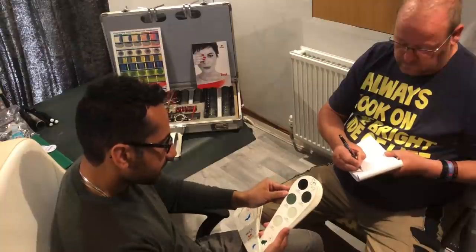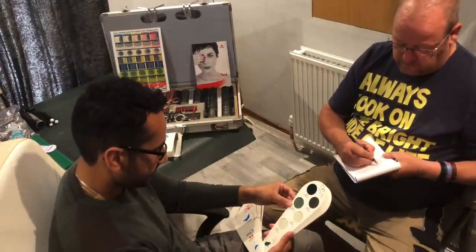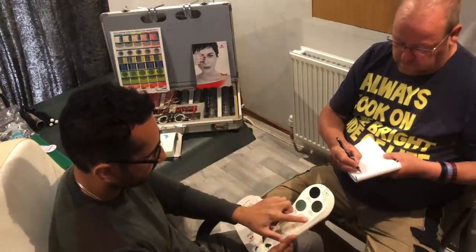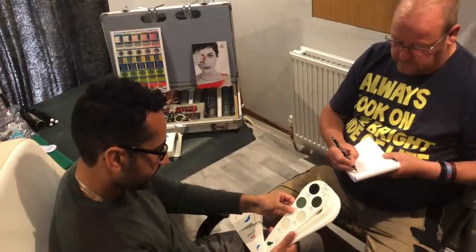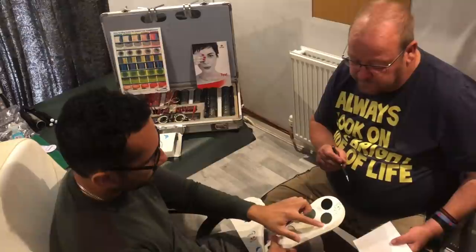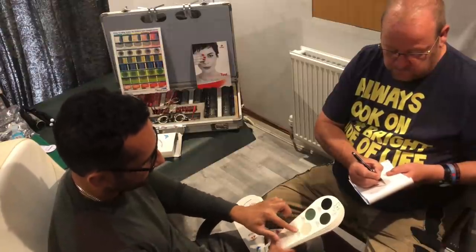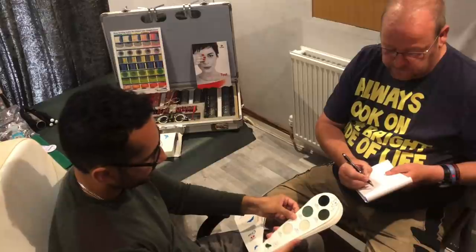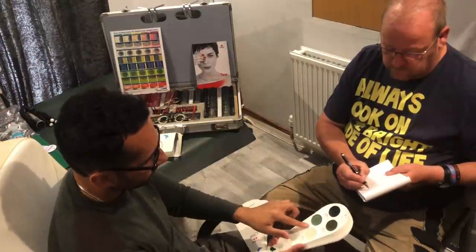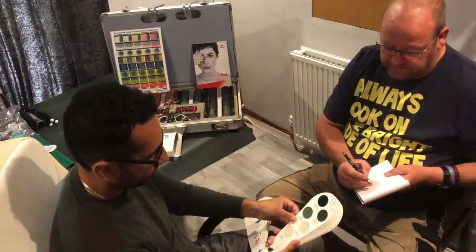I think the 75% absorption tint is nice for sunglasses — it's got a very gentle and mellow feeling green. It's one of my favourite colours. This one for sunglasses, and I'll consider the 25% absorption tint in my driving spectacles. Would something like this colour be okay for indoor computer use, or would I be looking at something different? No, I'll show you — we'll come across them in a moment. You tend to have more blues for that.